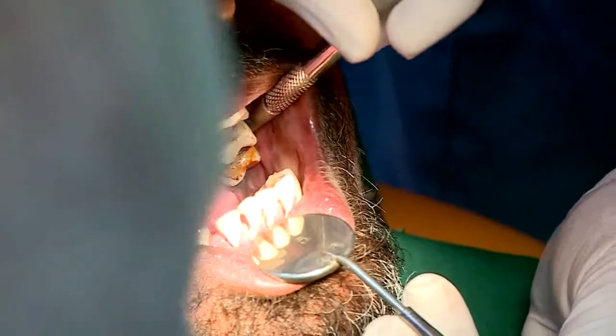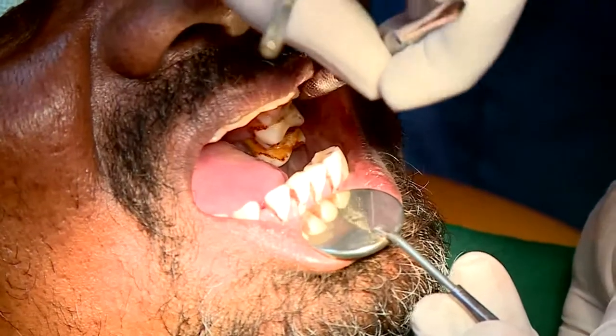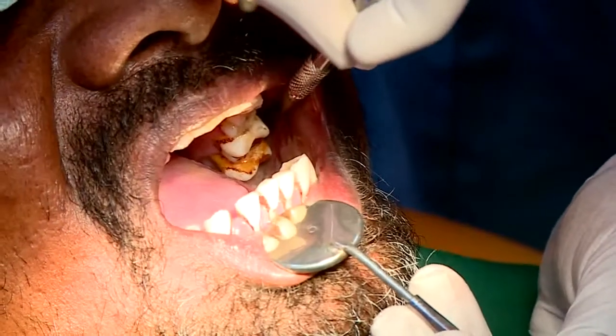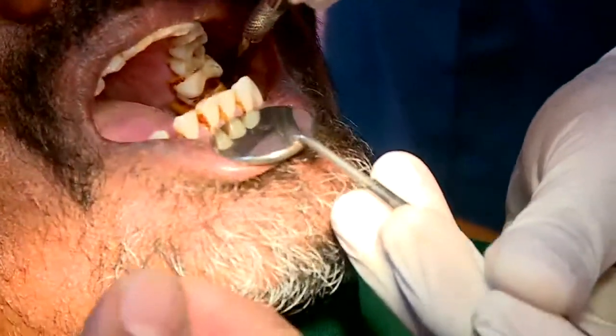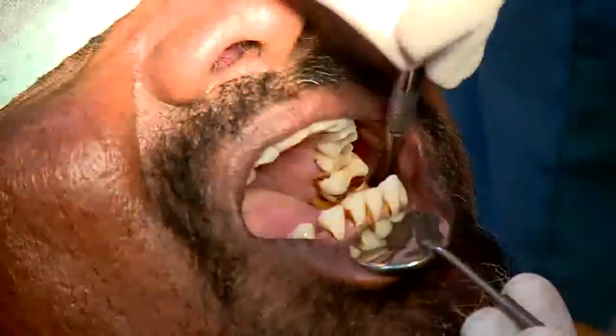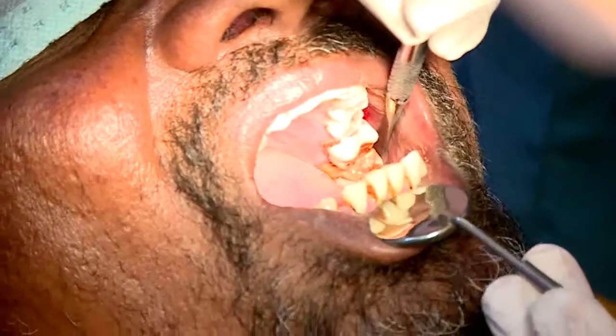Are you able to appreciate? The place of interest must be somewhere here. Yes. Okay, so that should be the area where the parotid papilla should be exiting. It is not very appreciable in this patient because of the marked fibrosis.